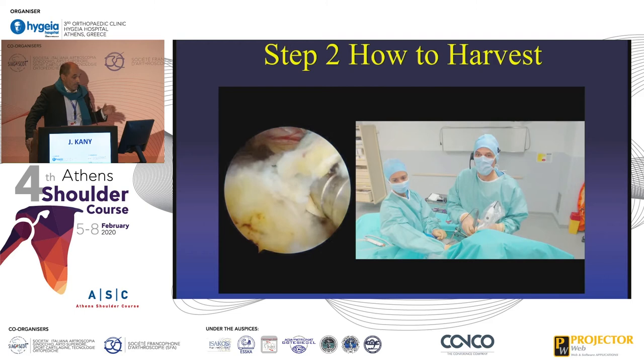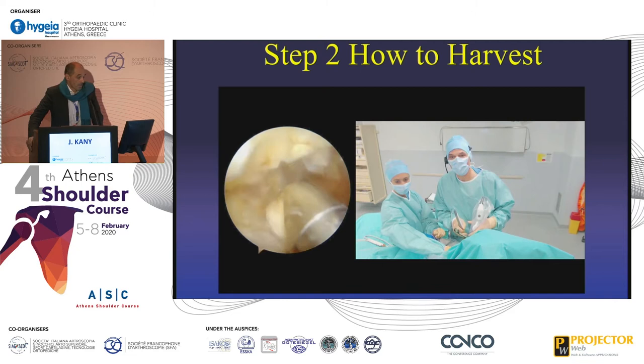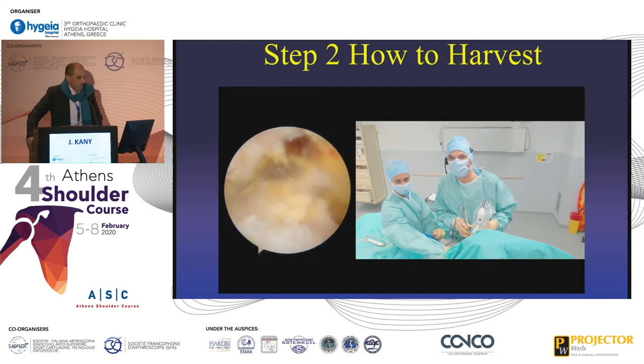So you have two options: either you take only the lat dorsi, or you take both. For many months now I prefer to take both, just because it's easier, and I think it's stronger — and probably my results are better now.